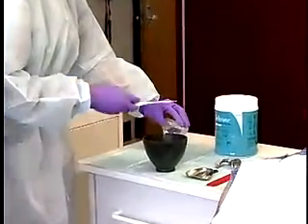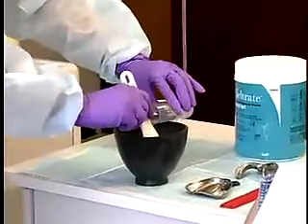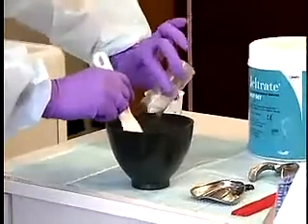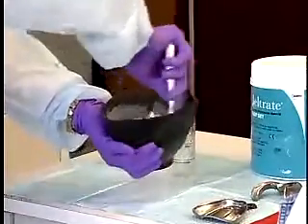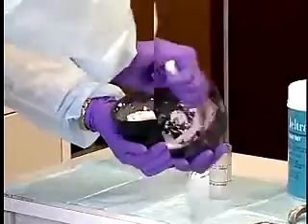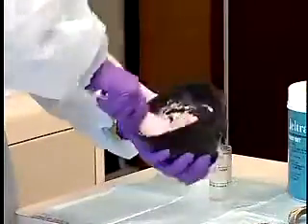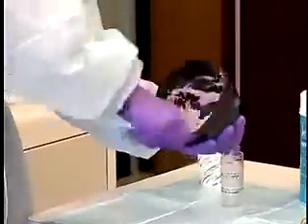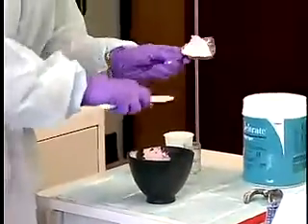Mix the alginate following the manufacturer's instructions, then load it into the stock tray.